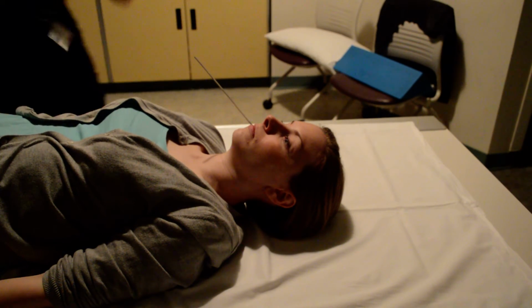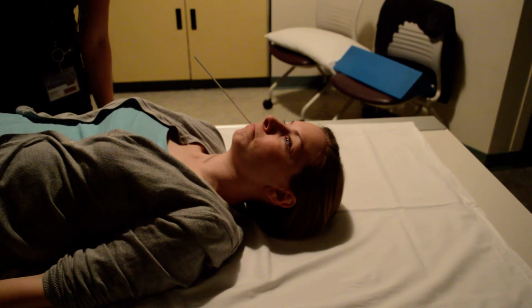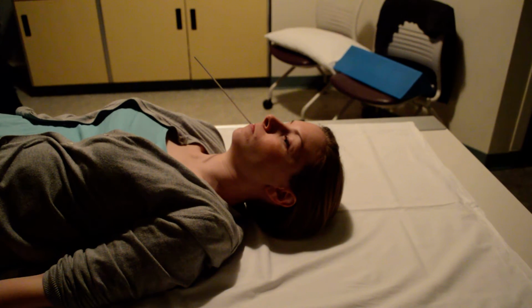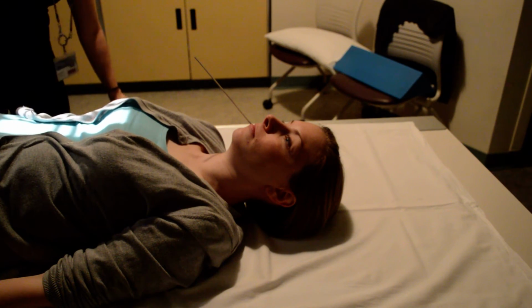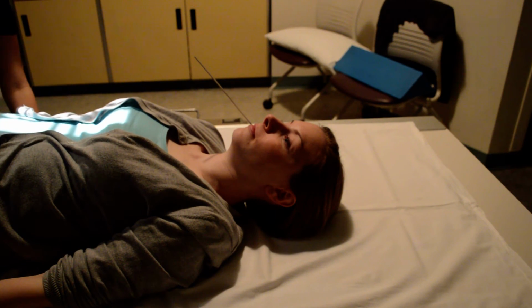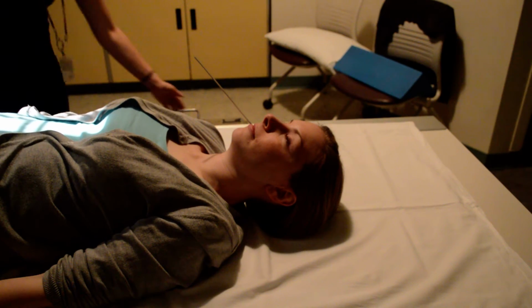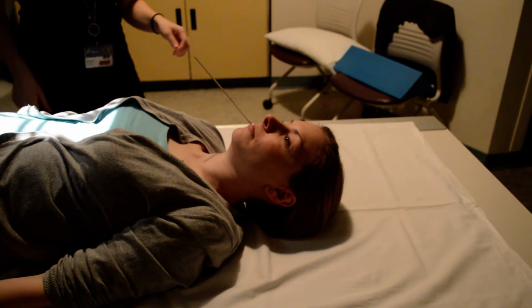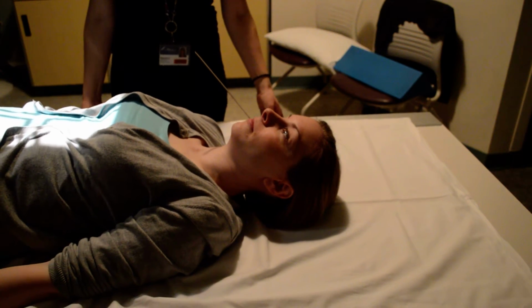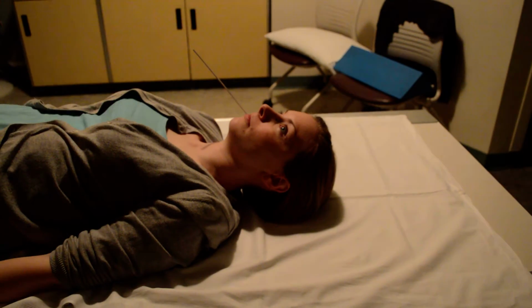Remember that once you get above about 20 degrees, you're going to have to adjust your SID. So I'm going to bring it to the 35 degree line. I'm going to utilize a 35 degree cephalic tube tilt. I need to line up my bucky. Change my collimation to match my cassette size. And then I'm going to adjust the camera so that you guys can see this.